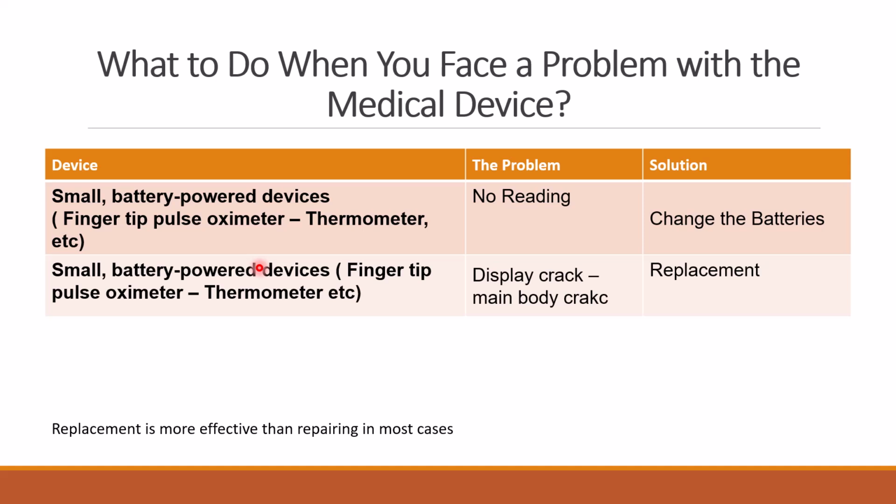So, first of all, the small battery-powered devices like the fingertip pulse oximeter, thermometer, and those devices. Most of them are Chinese brand. According to my experience in the place where I'm working now, about 60% of these devices are Chinese brand and not too expensive.